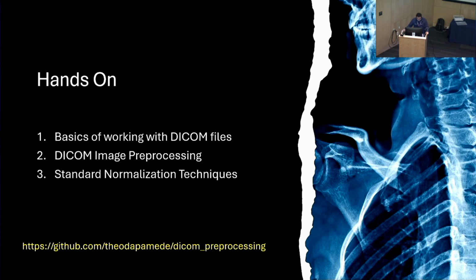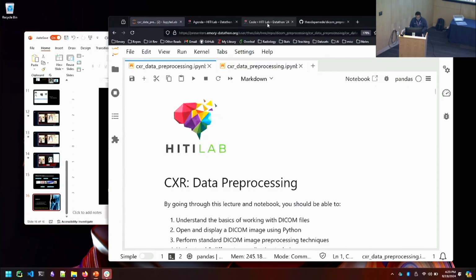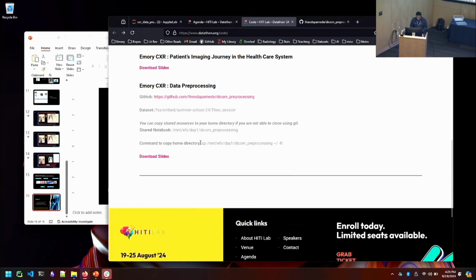No? Okay, so if you can get the notebooks from either this GitHub link or from this page. So you can copy the command here, yes.